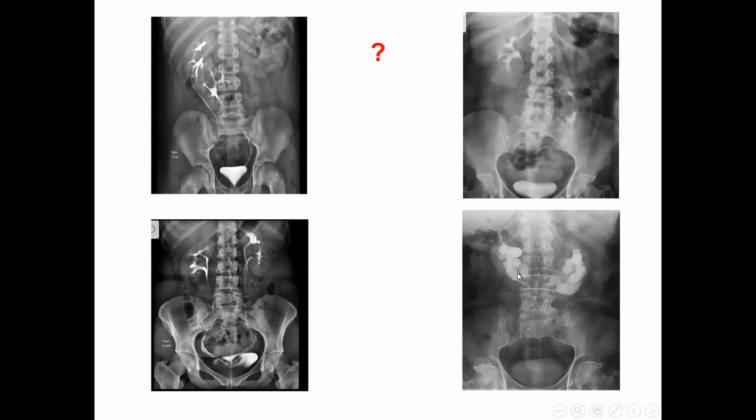What is this? Horseshoe. Remember the horseshoe kidney, as I've said, it's an abnormal orientation. Those are the pelvises come anteriorly. So that is why they get dilated like this. So more chances of stasis and hydronephrosis, more chances of stone formation and infection. This one, this is the kidney here, ectopic kidney. Okay. And this is cross-fused ectopia. This is renal duplication with intravesical ureteroceles.